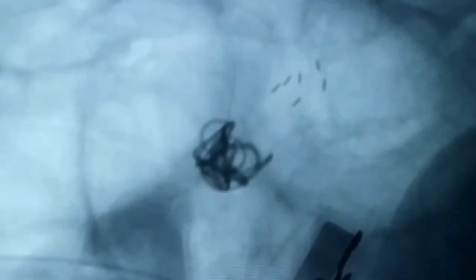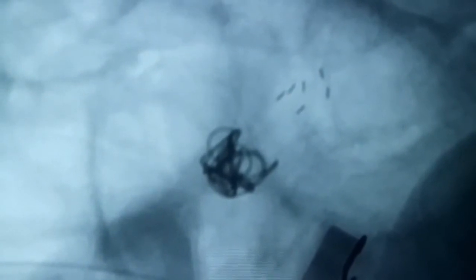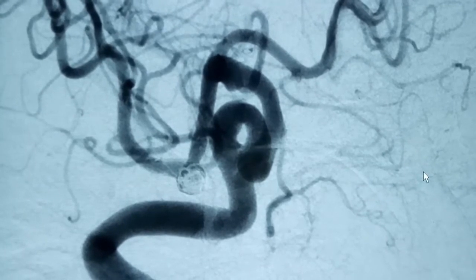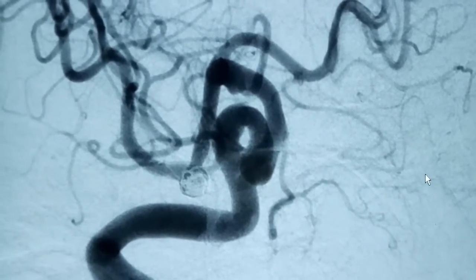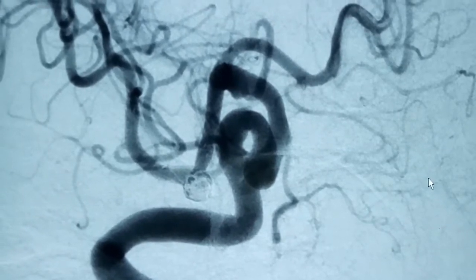We have protected the dominant branch, and the other branch is also protected by the stent, which prevents any coil prolapse into the superior M2 as well. We progressively coiled the aneurysm with the stent across, and could completely exclude this aneurysm from the circulation, with the stent protecting both the superior and inferior M2.